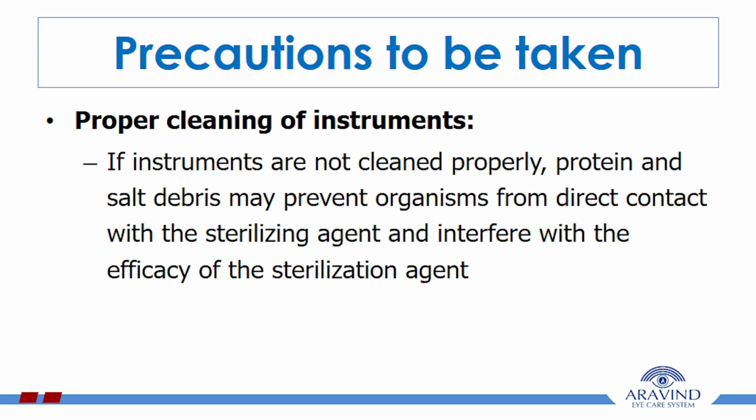Proper cleaning of instruments. If instruments are not cleaned properly, protein and salt debris may prevent organisms from direct contact with the sterilizing agent and interfere with the efficacy of the sterilizing agent.